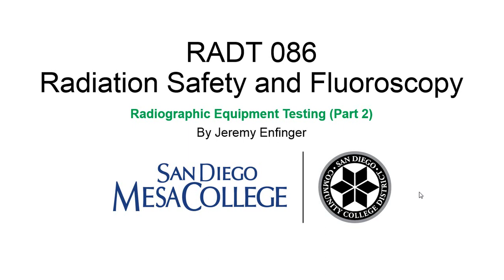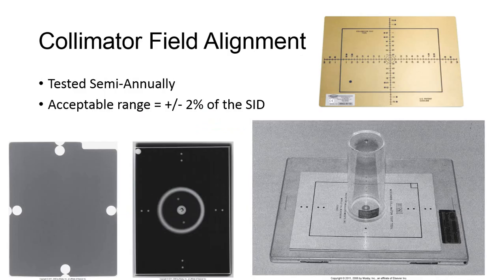Radiographic Equipment Testing, Part 2. When you adjust the collimation on the tube housing, the only visual indicator of the actual field size is produced by a light being reflected off a mirror in the tube housing assembly.